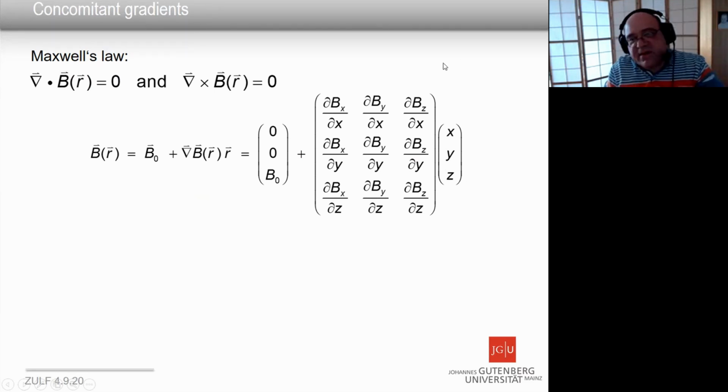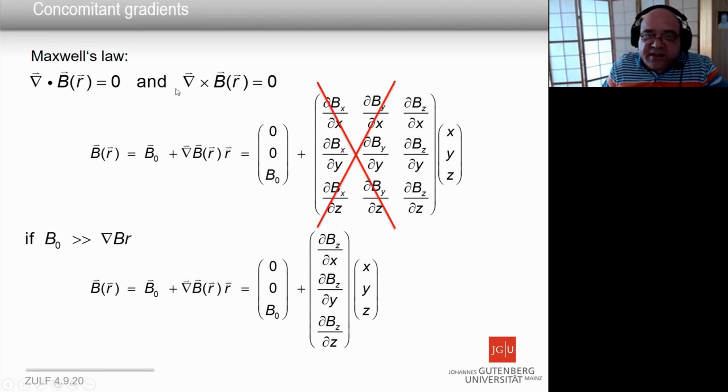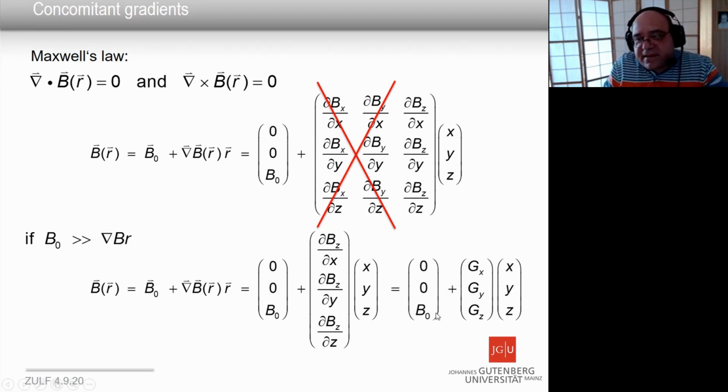And this happens a lot in the situation that we have here, where you have very strong gradients. And this is at the moment a real problem in this MPI business, where we want to build an MPI scanner that also can do imaging. Because originally this gradient field that you produce is, of course, a full tensor, and the assumption that you can only take the Z component of this field, for instance, for imaging, is only valid under these conditions: that B0 is much bigger than the gradient times the space coordinate. And if it's also constant, you can write it in the usual way.